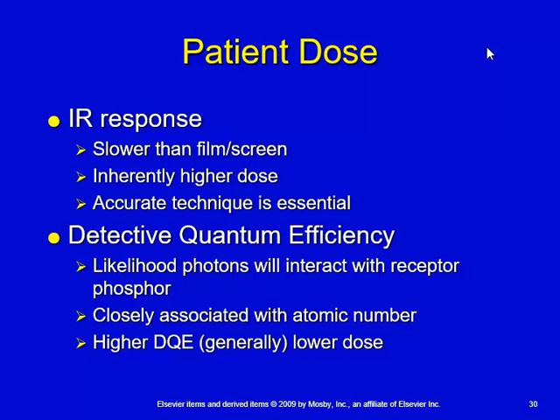And dose creep is a problem. It's an ethical, it's a moral problem, and it's just a laziness problem that hopefully, we've kind of addressed somewhat. So learn your techniques, make sure that you don't overexpose the patient.